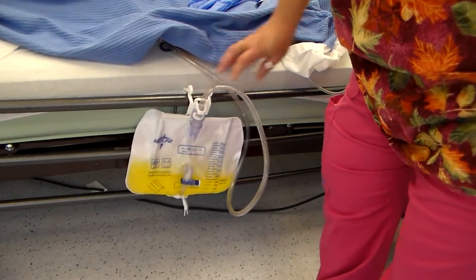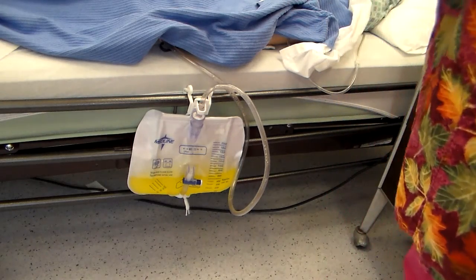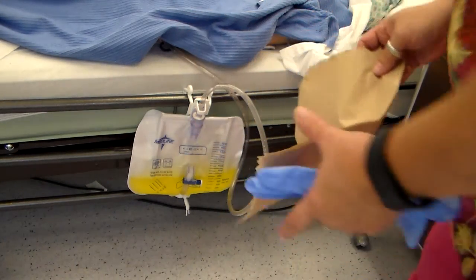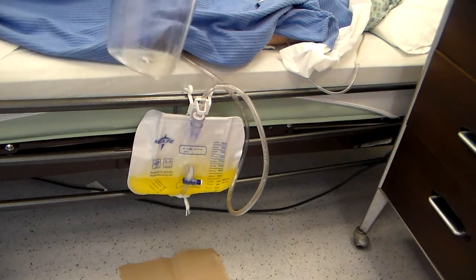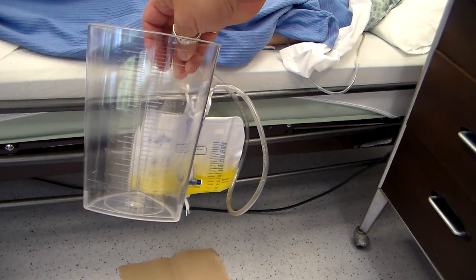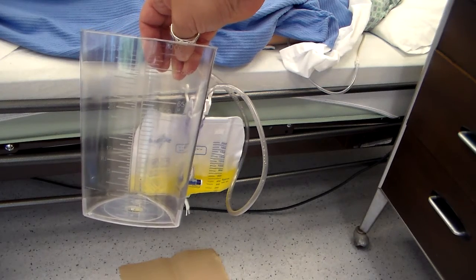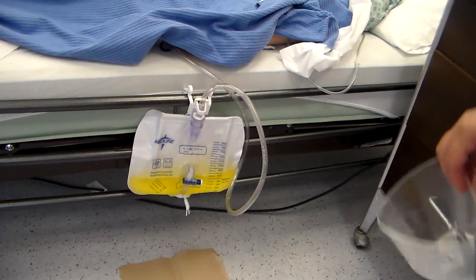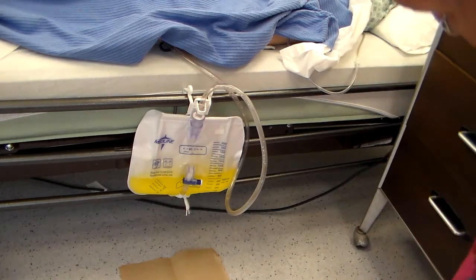So we got this here, and we need to empty it. How do you empty it? Well, first of all, you're going to gather your supplies. Your supplies are some paper towel to put down on the floor because you don't want to make a mess, and what we call a graduated cylinder. It has markings on the side where you can measure for I&O, which is intake and output. That'll become important when we finish emptying the bag. You will also need an alcohol pad and a pair of gloves.